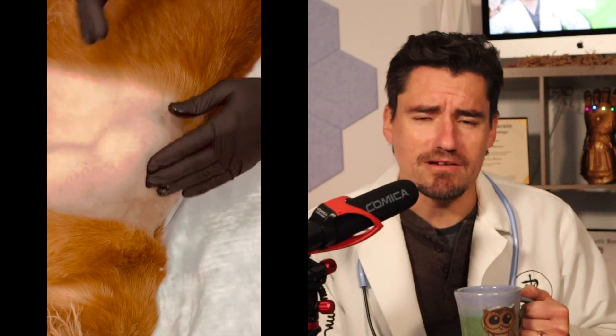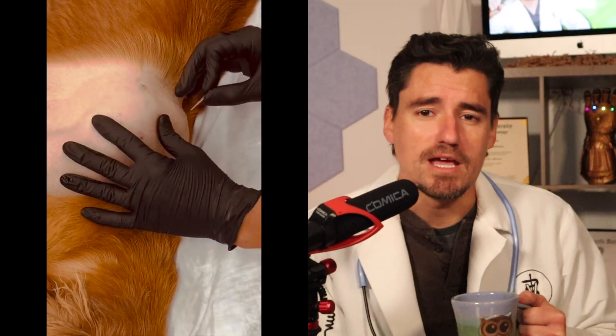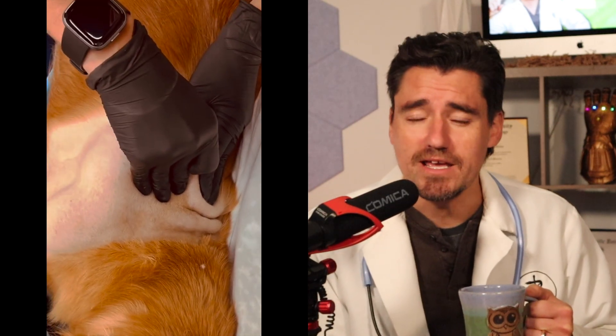As you guys can see right here, I'm showing where the infection may have started and where the dog may have been bitten, and it's led to all this. I'm first going to make an incision and then I'm going to squeeze out and drain it.